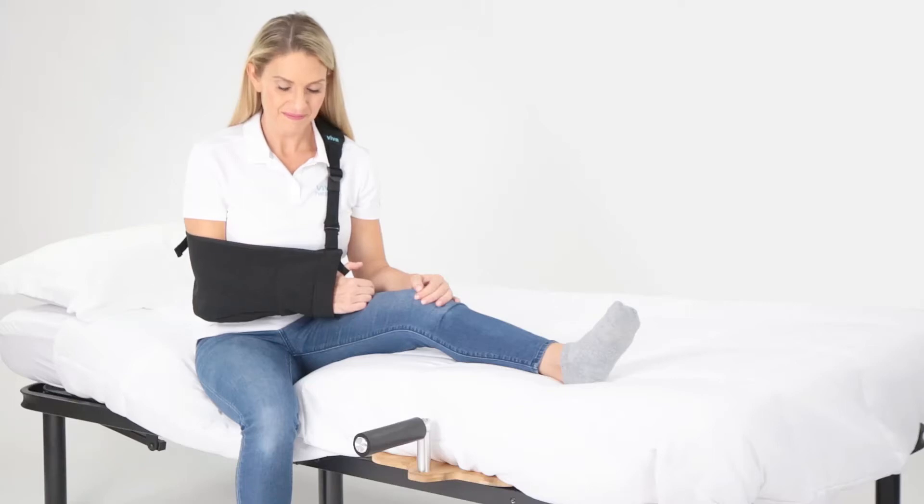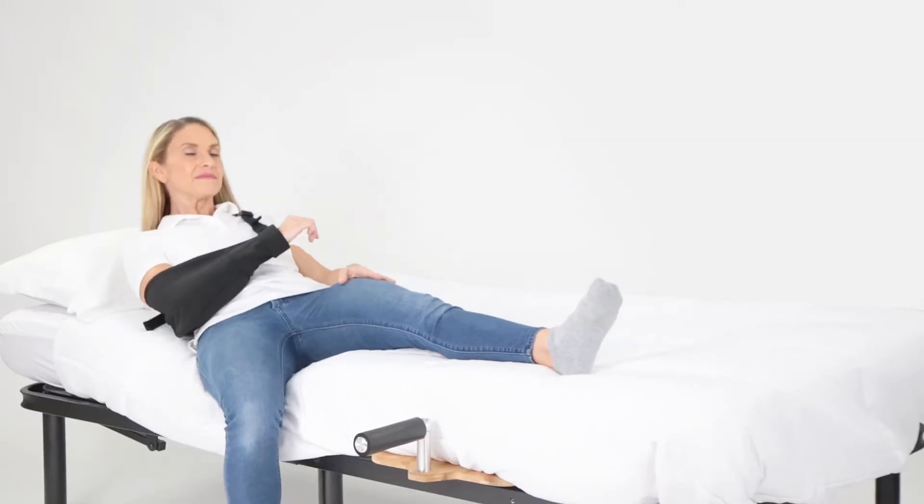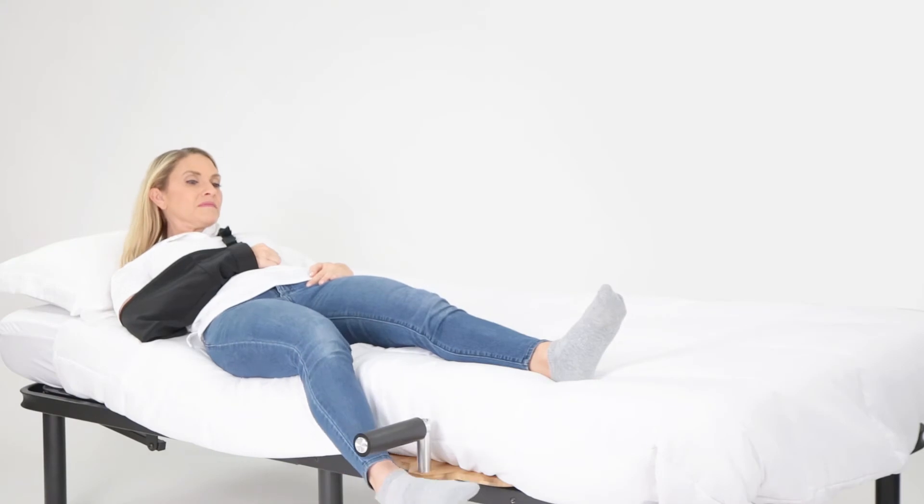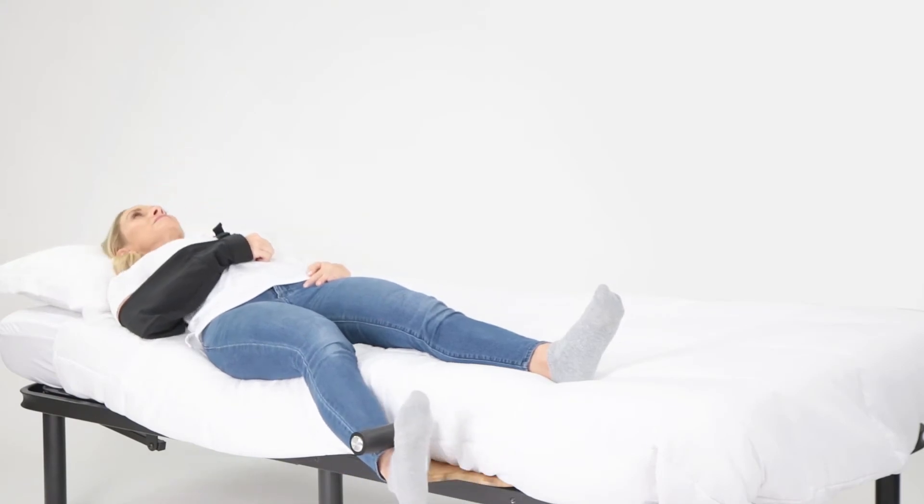Use the foot anchor to easily sit up in bed. With both legs stretched out, let your leg closest to the edge of the bed hang off of the side. Then tuck your hanging foot under the padded handle.